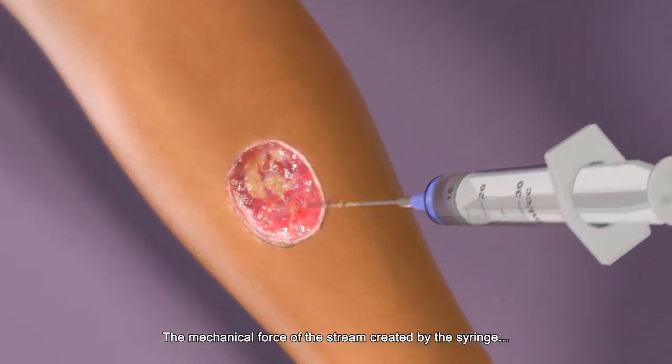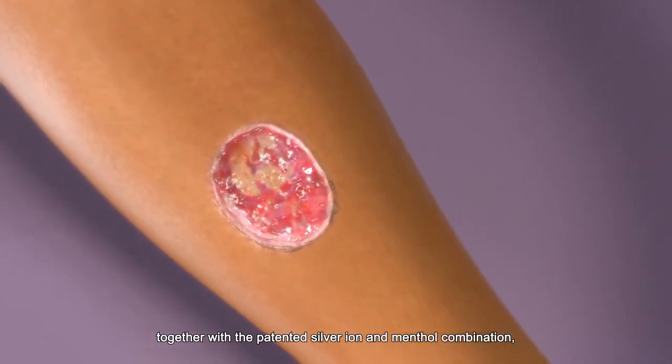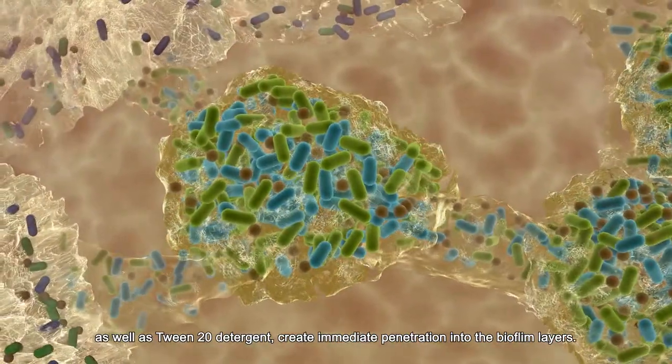The mechanical force of the stream created by the syringe, together with the patented silver ion and menthol combination as well as tween 20 detergent, create immediate penetration into the biofilm layers.